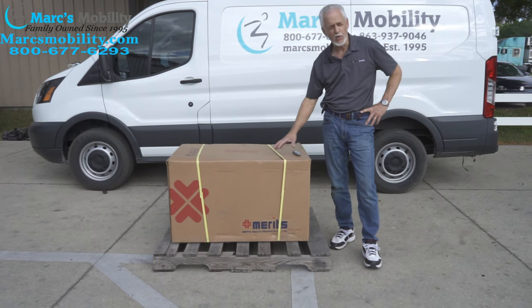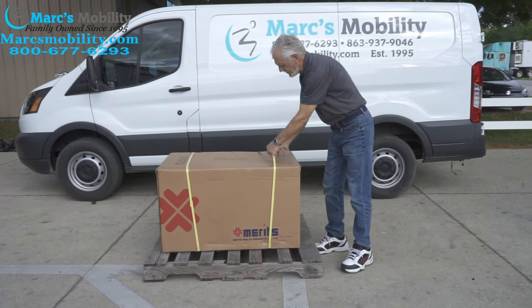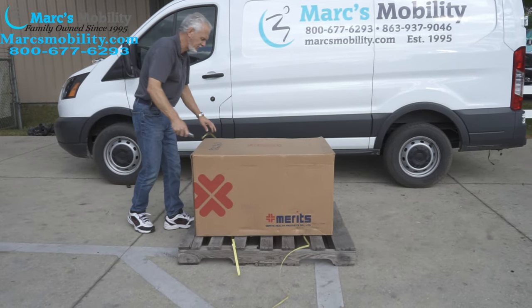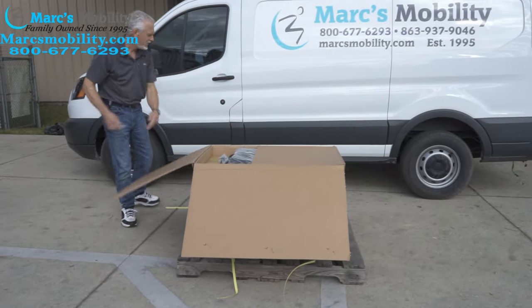This is the way it would be delivered if you ordered one — it's still in the box. The first thing you would do is get yourself a good box cutter, cut the yellow straps off. Sometimes they're already cut off when you get them. Cut your straps off and open your box.